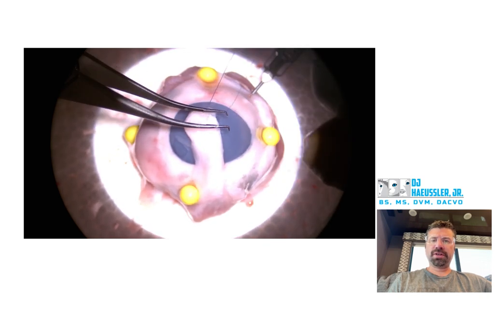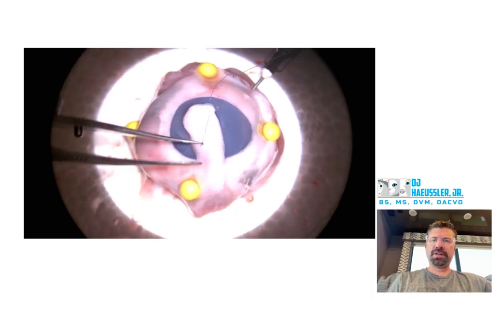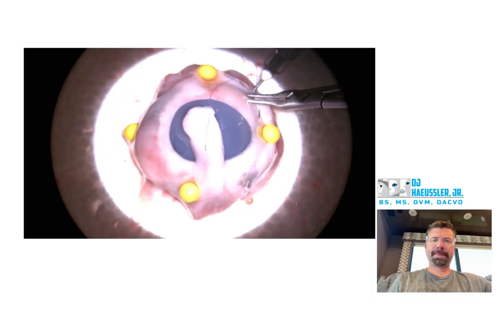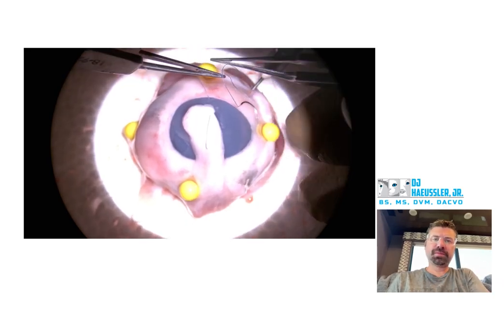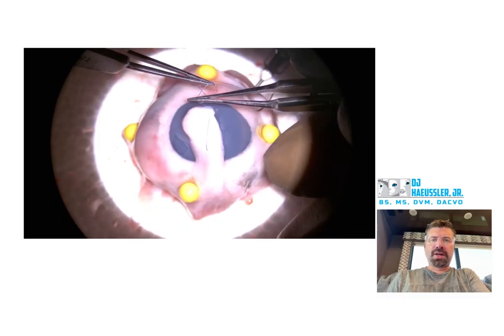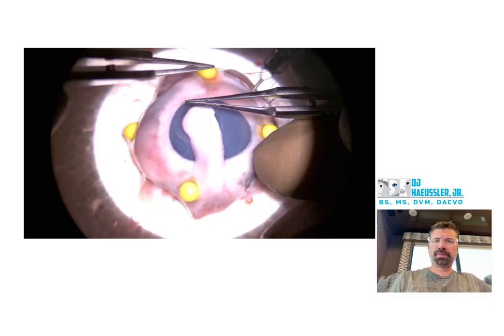Good job holding the edge of your cornea while you push that through — that's good. Good job putting your needle off in the fornix, that's great. Good job switching over to tying forceps, that's also good. Good job passing through.